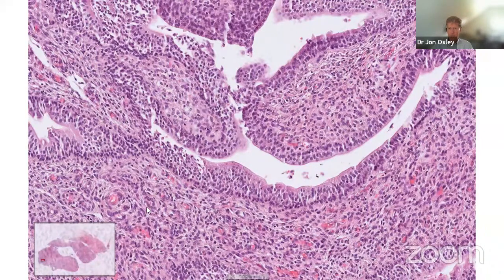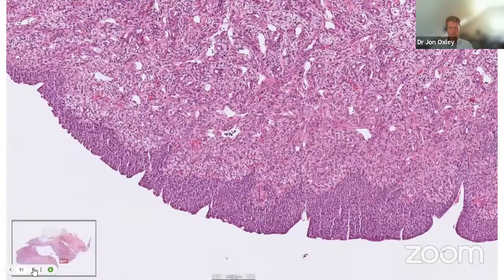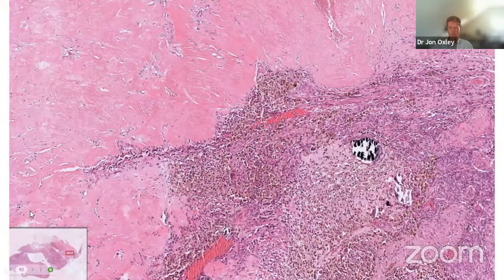And the stroma looked a little bit ovarian. And there's more pictures of what apparently looked like urothelial. And in the other areas at the top, there was a bit of fibrosis and hemorrhage with hemosiderin pigment.